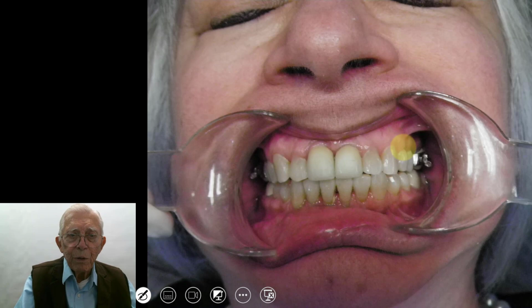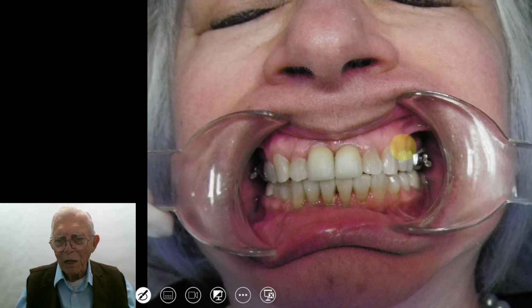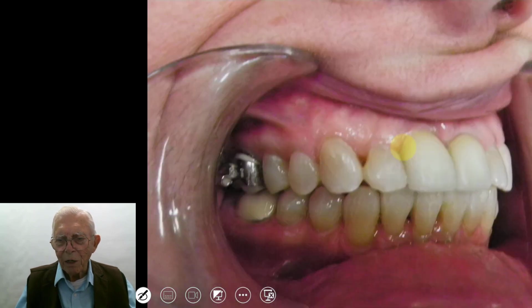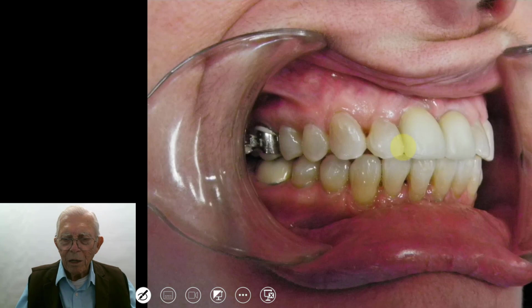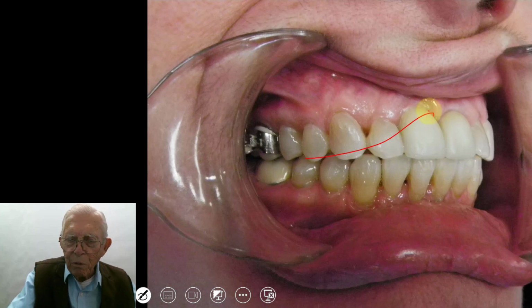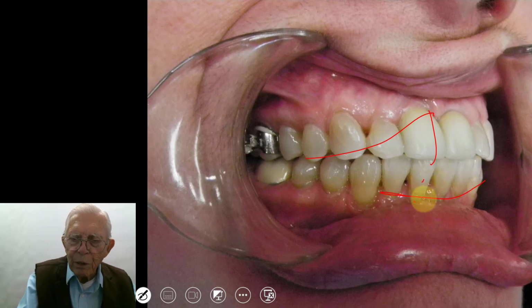And you have to keep these cleaned off while you're doing this. When they come in, you do a little scaling of those teeth and make sure they're clean and everything else. And you bring them out, and you can actually level those out. Remember, those teeth were way up here. We pulled them down in here and guided the root, and we put them in a space.